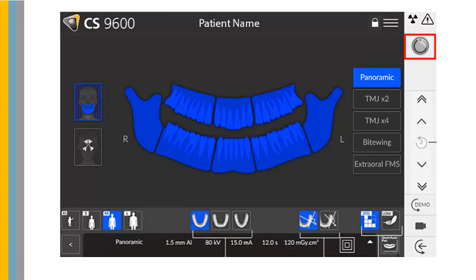The Ready Indicator uses color coding: black indicates the unit is not ready to start acquisition, orange indicates the unit is preparing for acquisition, and green indicates the unit is ready to start acquisition. The Warning Indicator for Ionizing Radiation warns about radiation dangers: blue indicates the x-ray is enabled, and gray indicates the x-ray is not enabled.